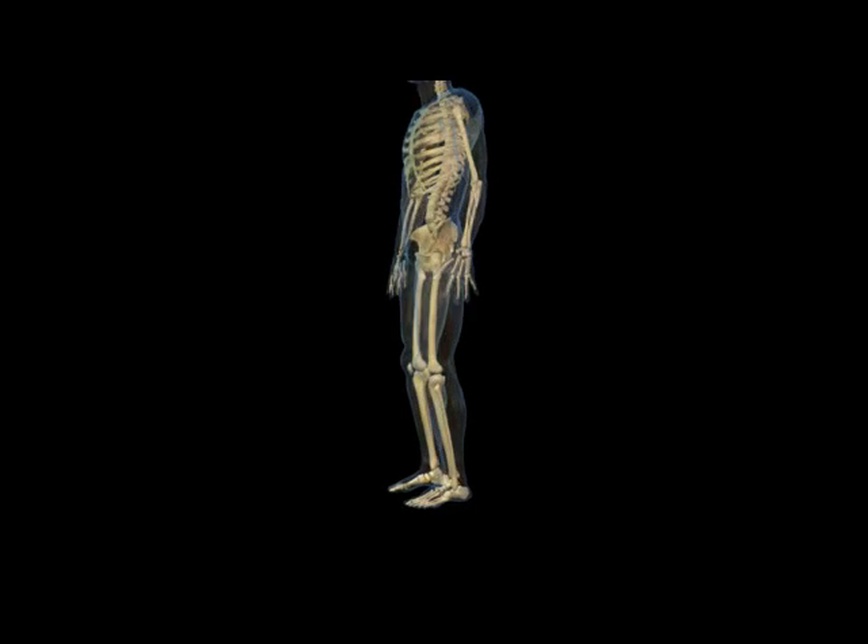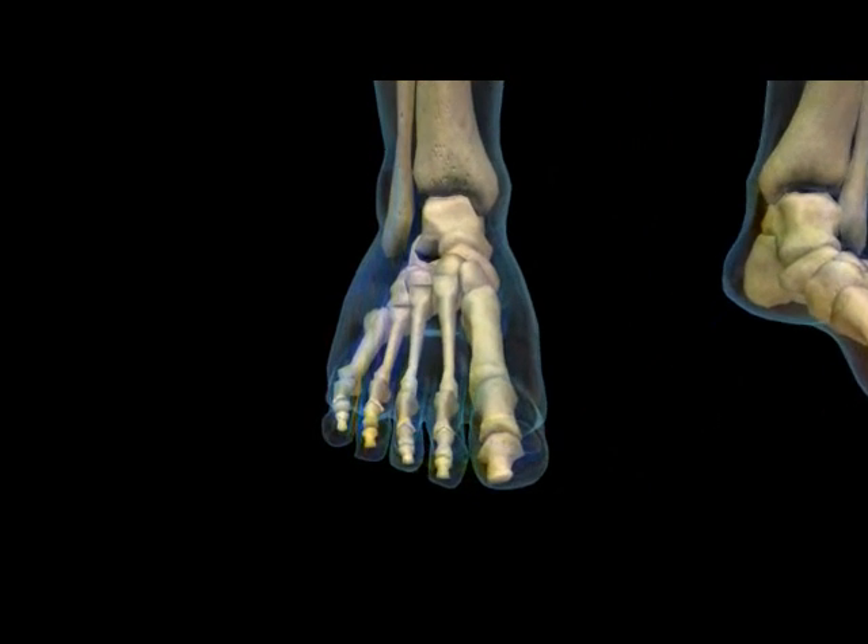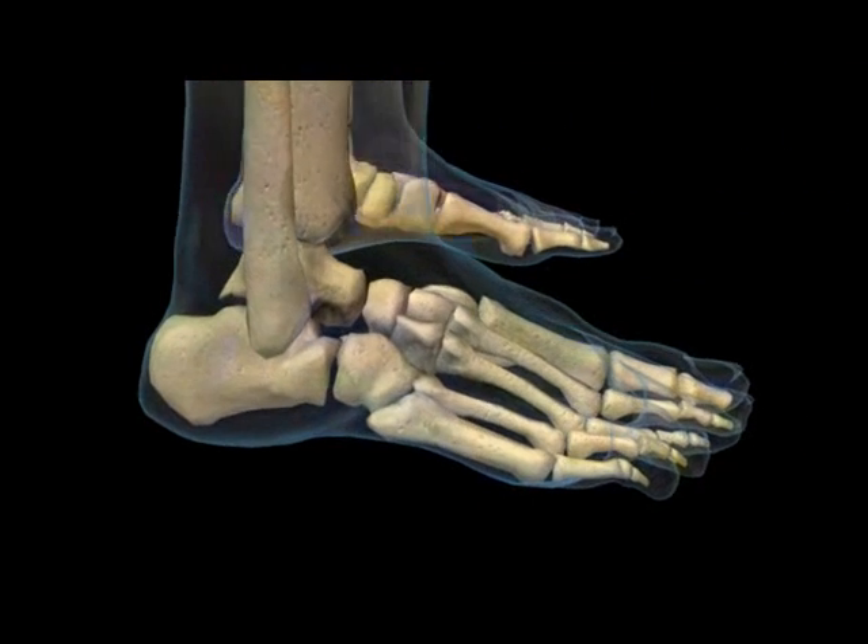Welcome to the HyperCure animation. The foundation to the body all begins down in our feet, which are extremely important in order to maintain proper balance and weight distribution.